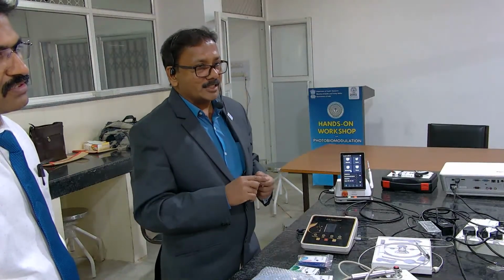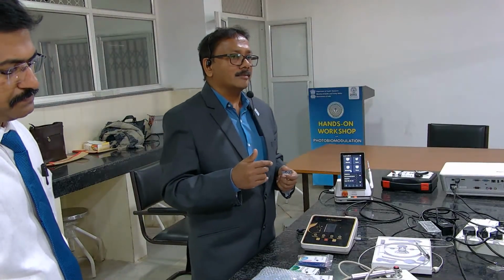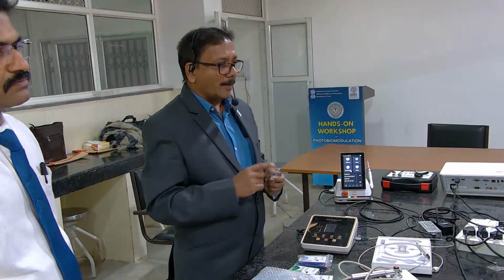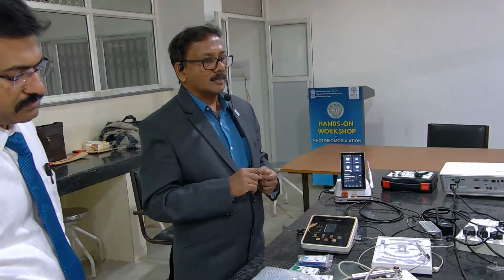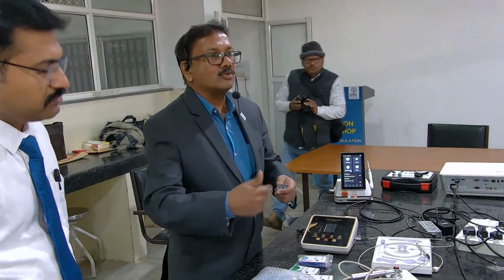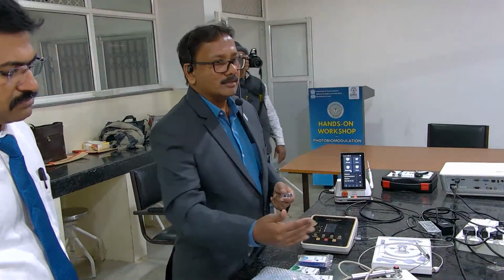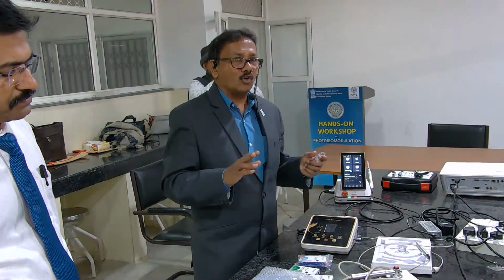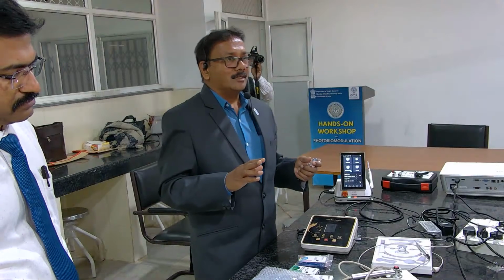So what you can do in such cases, suppose you want a deeper depth of penetration, whatever energy you are applying, you have to apply it for 60 seconds to 120 seconds. Slowly, it will take longer days. That's the one. So it is not any rocket science that you have to master.